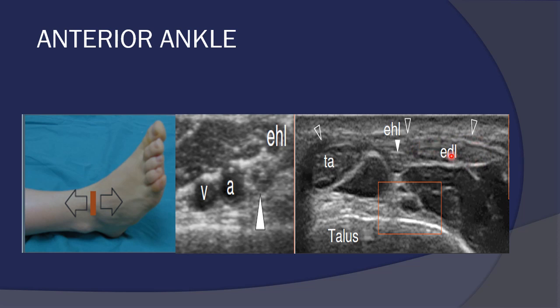Say this tendon, I don't know which one it is. I can just follow it by the probe also till I see the insertion into the big toe. So this means that this is the extensor hallucis longus tendon. And by exclusion, the tibialis anterior is the medial one. Moreover, we can extend the examination to examine the anterior tibial artery and its venae comitantes, as well as the accompanying deep peroneal nerve.